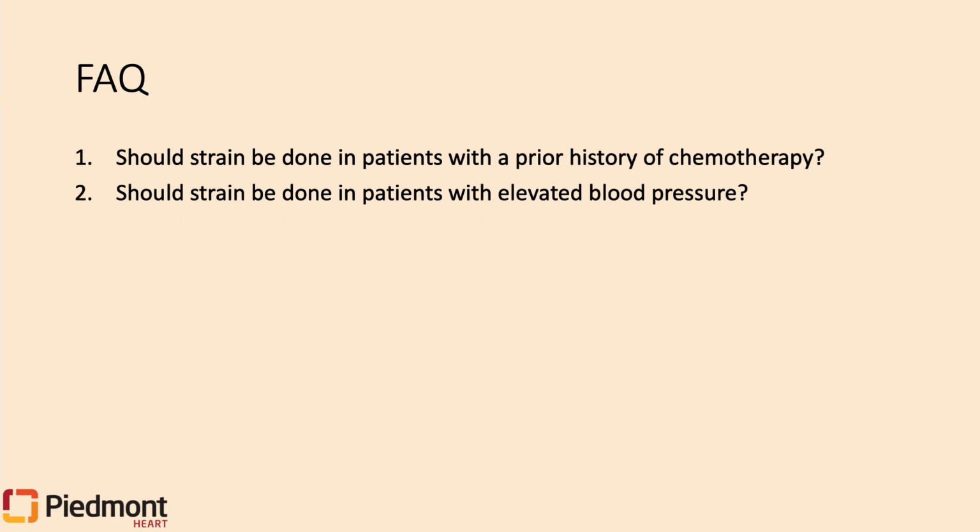Should strain be done in patients with elevated blood pressure? Yes. If the patient who is coming for an echo has strain ordered for them, or you see that they fall under one of our 4 categories, please obtain strain. Strain is load dependent, meaning it is sensitive to your preload and your afterload.